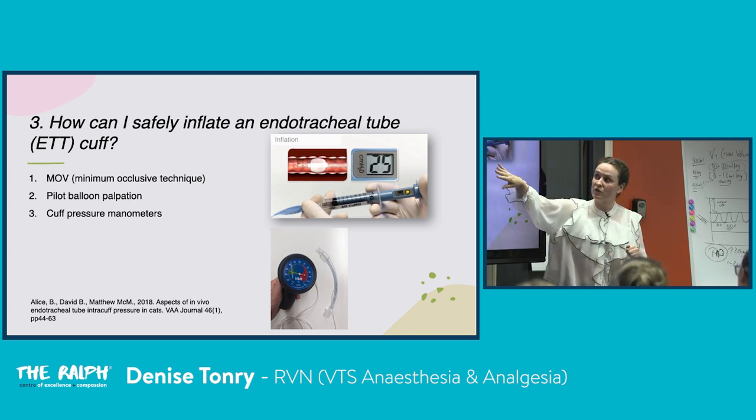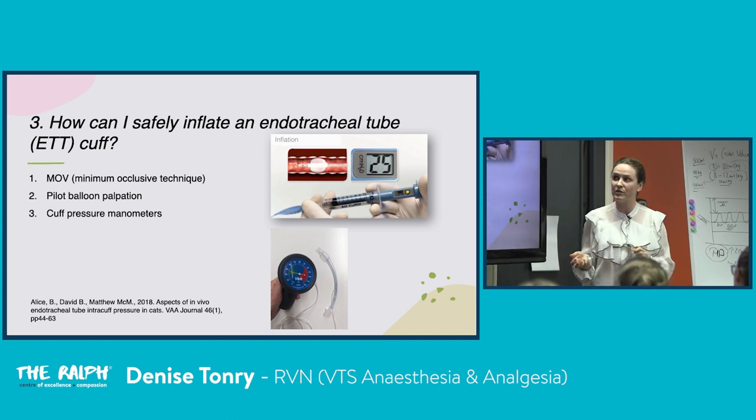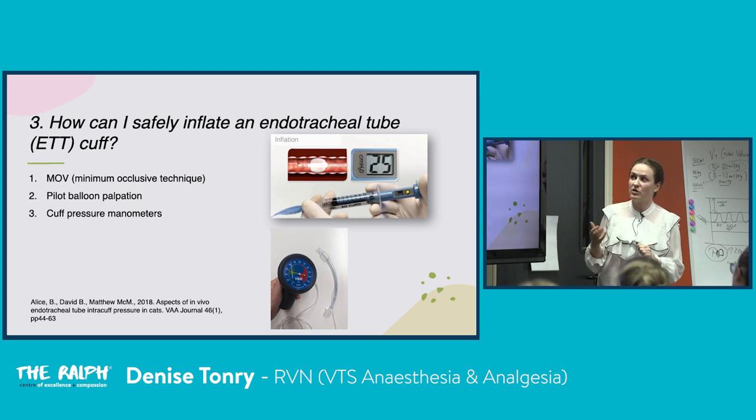So this is kind of the pitfall with these two ways of inflating cuffs. We very rarely see the fallout of this, but again, as I was studying and learning more and more about this side of nursing, I realized how much the little things mattered and probably how much the anaesthetists were taking into account every time they were anaesthetizing a patient. And you can bring all that with you to the table.